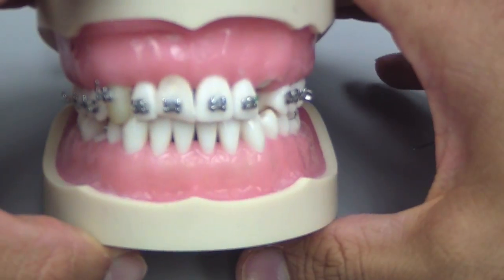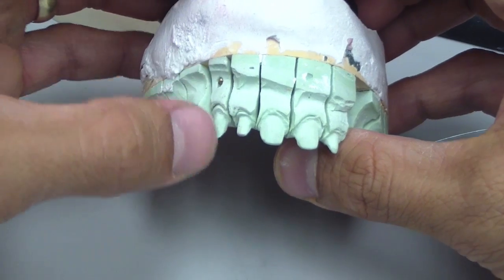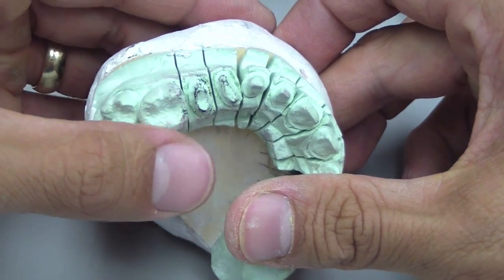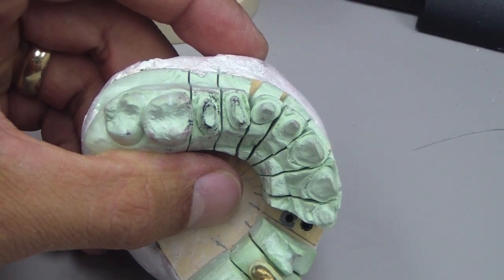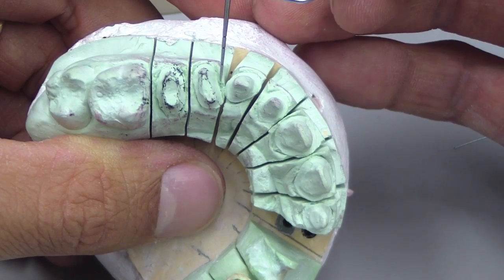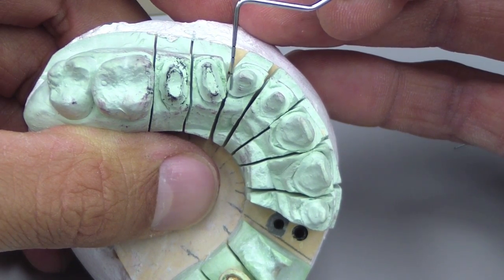What we want to talk about today is an anterior tooth. In this case we're going to talk about a canine, and this has relevancy in my own life because we extruded tooth number six, or FDI tooth number 13, and it was fractured at the gingival margin. This is post-extrusion. We gained approximately four millimeters in approximately two and a half months — it was fairly fast. Just finished cementing these fixed restorations in lithium disilicate Emax. Look at this root proximity issue — see how the margin of the bicuspid is extremely close to the distal margin of the canine.